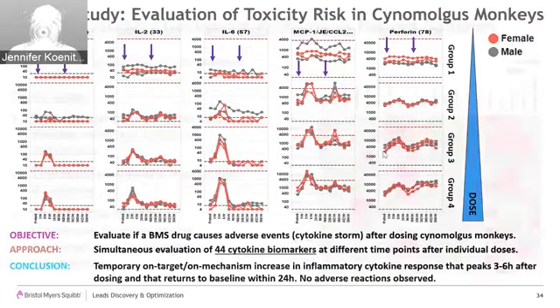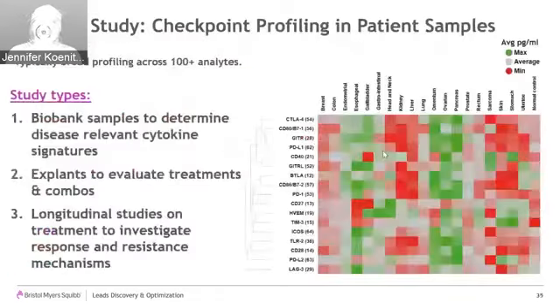In my last example, I want to talk to you very briefly about our work with patient samples. And this is where we most broadly apply the checkpoint panel 1 that Jan had introduced. When we obtain these types of patient samples, we typically perform very broad profiling, as much as sample volumes permit, often for 100 or more analytes, including the checkpoint panel.